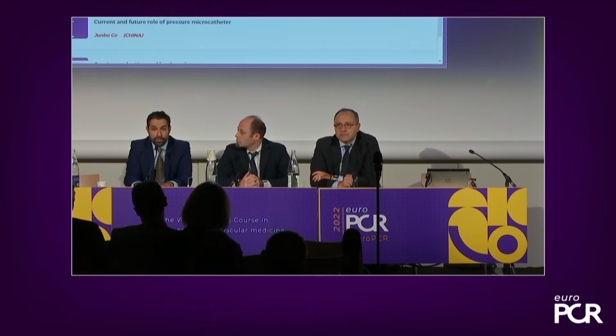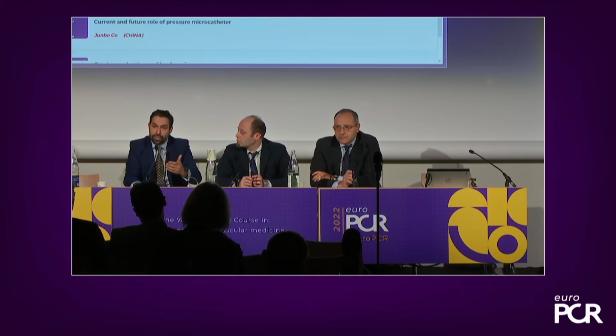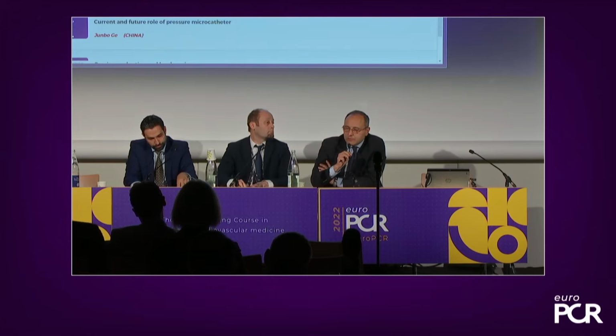Nevertheless, particularly in the right coronary artery, in situations where the flow is not so fast in resting conditions, when you do a post-PCI pullback, you cannot see focal pressure gradients. You need to increase the flow 3-4 times with hyperemia in order to unmask residual pressure gradients. So now we have learned quite a lot. That is a particular phenomenon related to the right coronary artery, that hyperemia is required to unmask these residual focal pressure gradients. Hold on, Carlos, because I'd like still to hear your thoughts on the PPG.